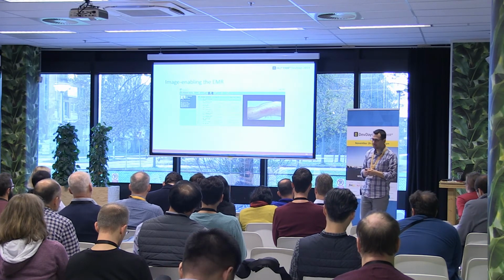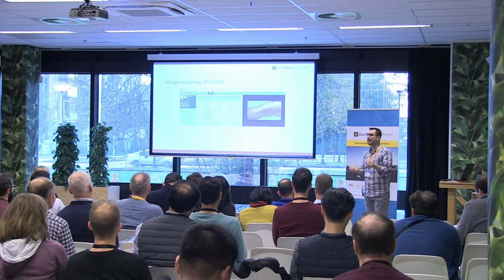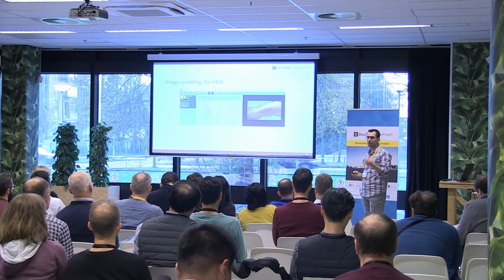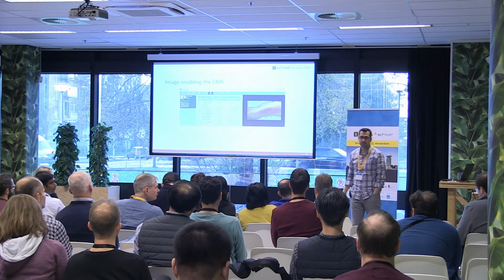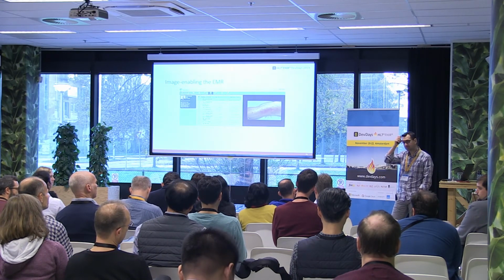So just a big disclaimer, that's one of the reasons why DICOM exists. It also, one of the things it manages is how you display an image. So a real DICOM viewer reads that metadata and can alter the display of the image accordingly. Typically you have lots of viewers that are really, really DICOM native and driven by DICOM. Do you see a growth in the amount of viewers in this space, in the EMR?